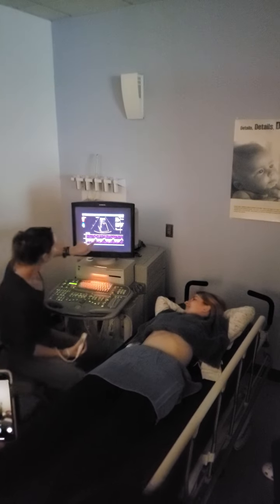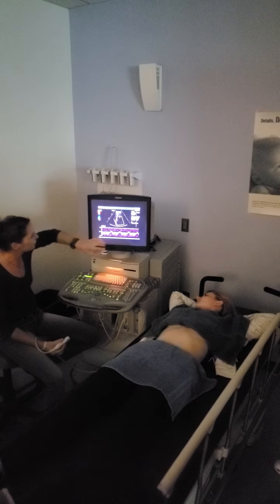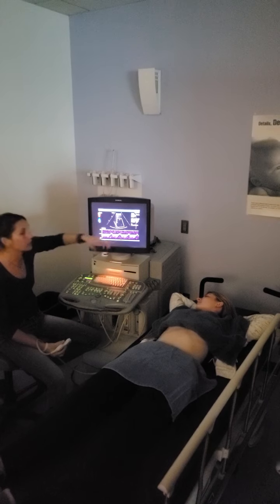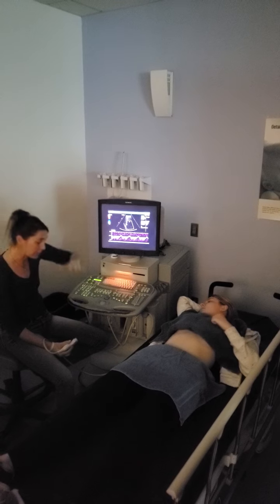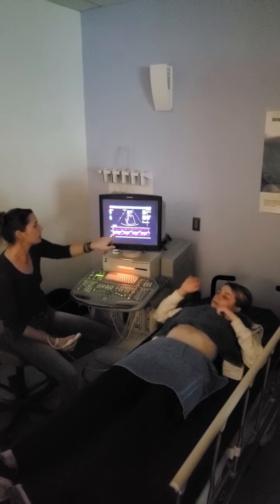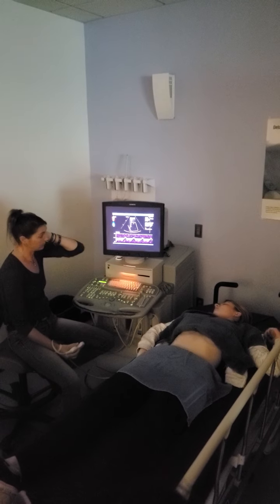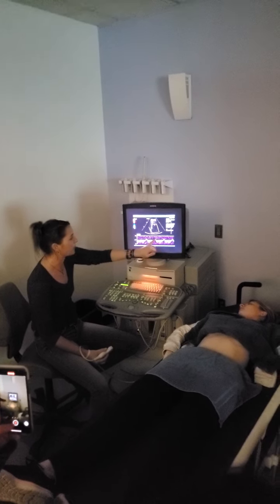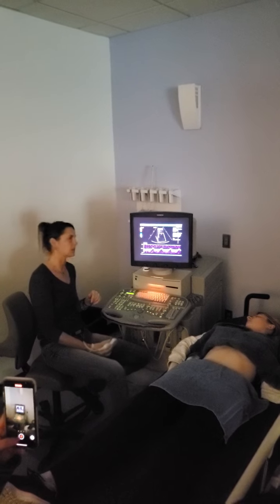So this is where the blood is able to enter the heart, so it's going towards the heart, and then a little bit of pressure difference towards the heart, and then it's like, hey, the door's shut. Now we've got to back up a little bit. So we're going towards the transducer, we should be going into the heart, and we're like, wait, we've got to go back a little bit. So this is called the Wonder Woman sign. And they call it truly triphasic flow, because it goes forward, then backwards. So it has changes. I'll make sure Rain talks to you guys about this.